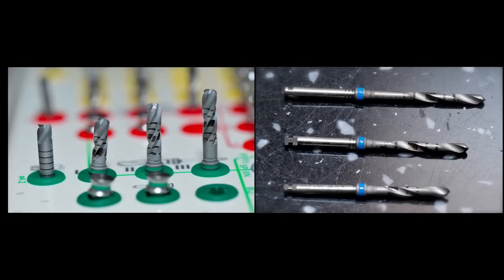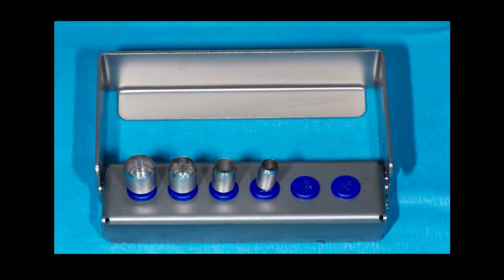Here's another example of some pilot drills in three different lengths. The system's very elegant. As I said, I'm virtually always just doing these through a punch hole in the gingiva, so I'm not reflecting a flap, and I think that's why the patients have a comfortable experience. This is the gingival punch instrument kit that I bought — it's a rotary tissue punch and the one I'm mostly using is the smallest one, the 4.0. The kit doesn't have a 3.0 but I've got some hand tissue punches for 3.0 situations, and this works out really nicely.